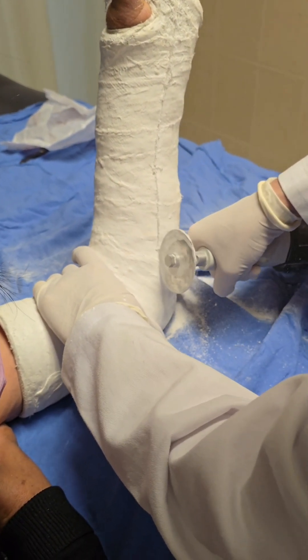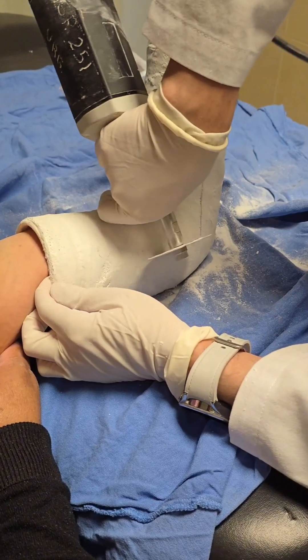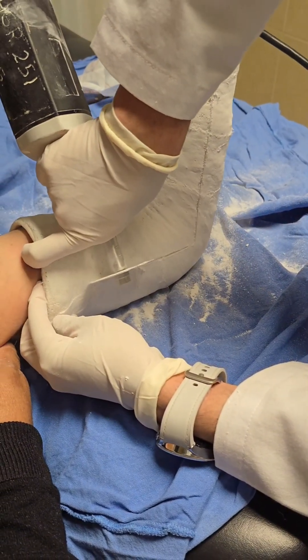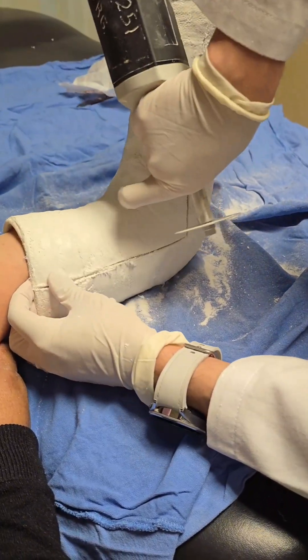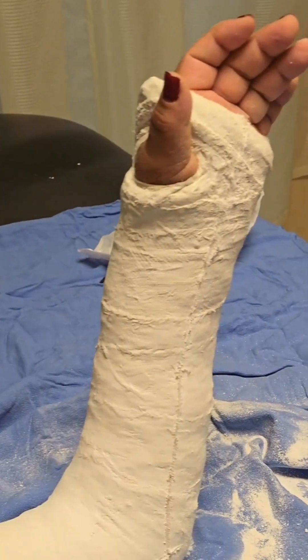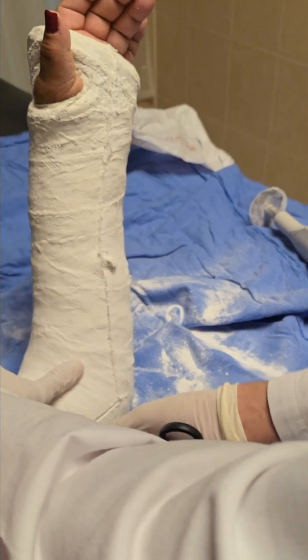Step by step — how the cast is removed. Step one: preparation. The patient is comfortably seated with their arm supported. The healthcare provider ensures there's adequate lighting and examines the cast to plan where the cuts will be made. Typically, the cuts are made along the sides where the material is thinnest. Step two: making the cut. The cast saw is powered on and the provider gently applies it along the predetermined cut lines. The trick is applying just enough pressure to slice through the cast without digging into the skin beneath. The saw's vibrating blade does the work as the provider moves slowly and carefully to ensure a smooth cut.